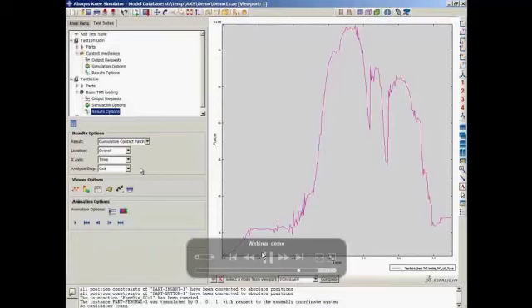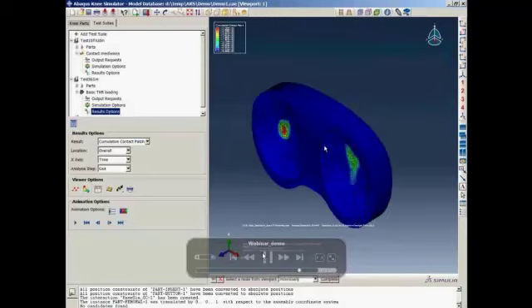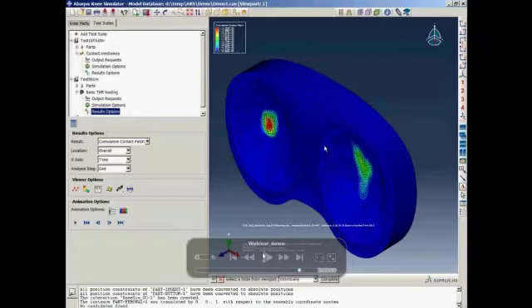You can also visualize contour plots of, for example, cumulated contact patch. This output again is created specifically for the knee simulator. Instead of contact pressure for one single frame, this is the summation of contact pressure over the entire loading cycle. The reason for providing this output is to give a visual on where the points have been participating in contact, and which indicates where the wear on the polymer part will be.